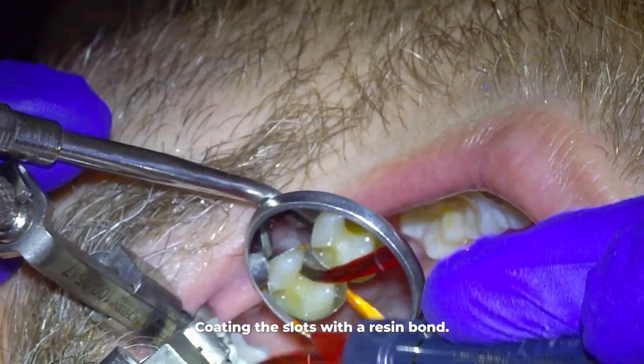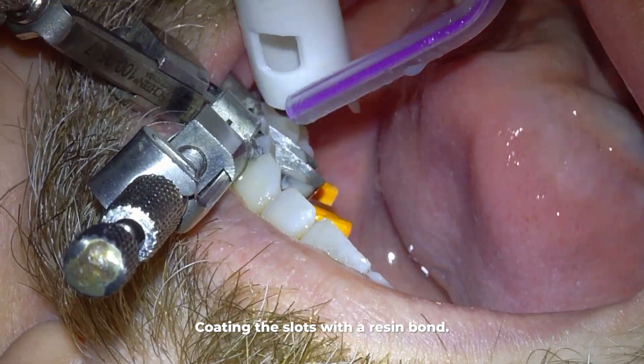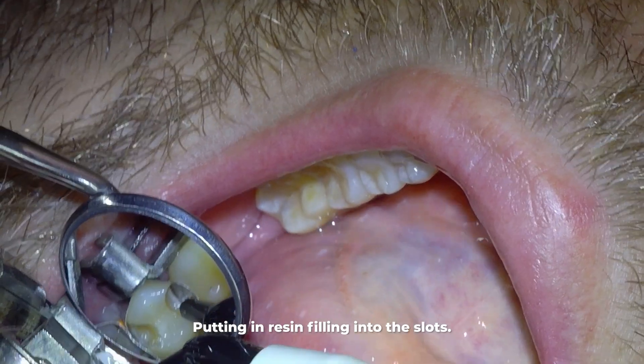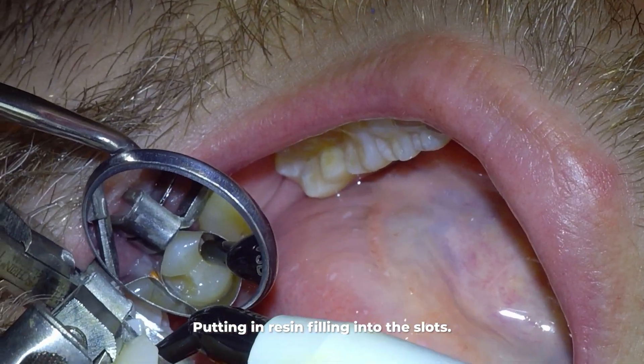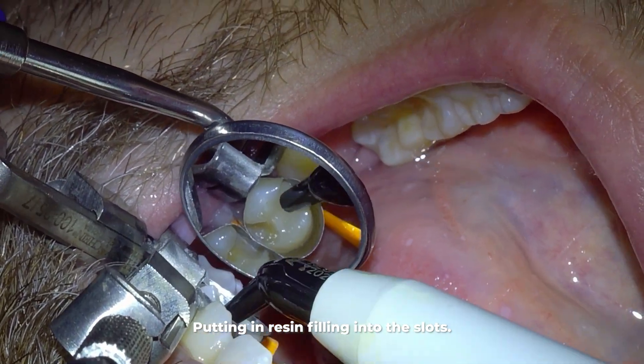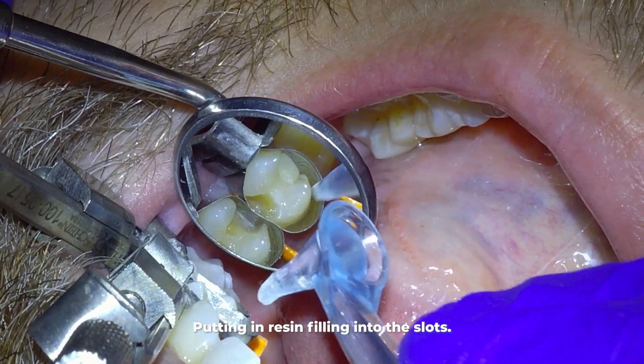For the best hold, I scrub the bond into place and remove the excess with light air and suction. Then I cure that bond with the light. Next I put resin filling into the slot I made — it has a doughy texture that will integrate with the bond and harden when I use the light again to cure or set it.